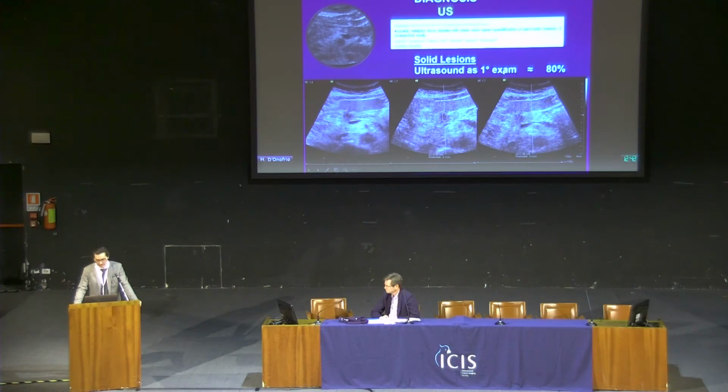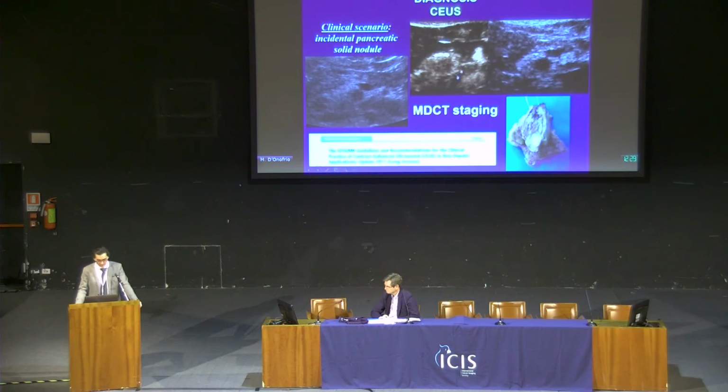And in our department, we have a lot of lesions coming from ultrasound, and also in Italy, I have to say, ultrasound is the first imaging modality. So to improve the first line, we can have a better diagnosis.